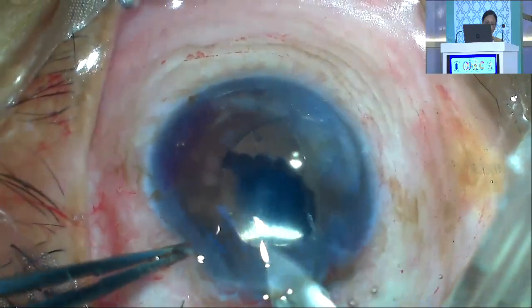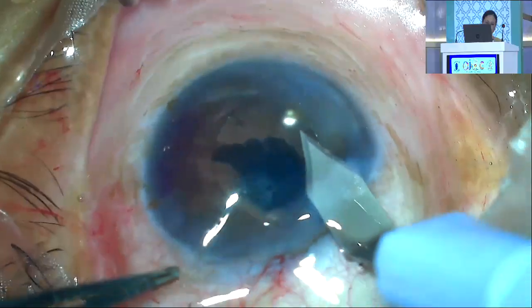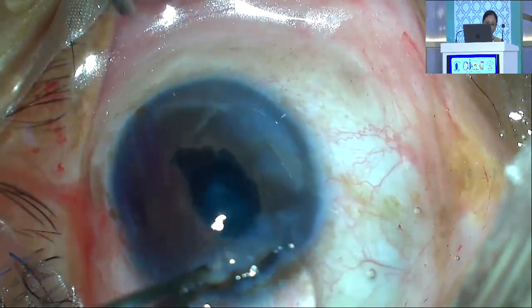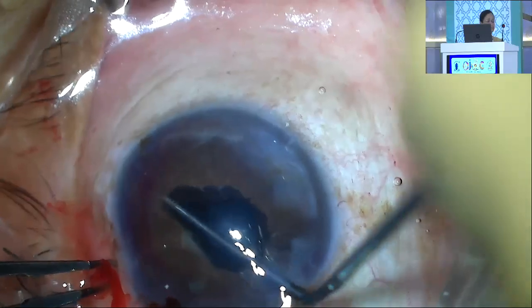Now the incision was further increased to remove the whole optic along with one intact haptic. Although it wasn't the original plan, it was the safest path forward. Posterior synechiae was released from the capsular bag.